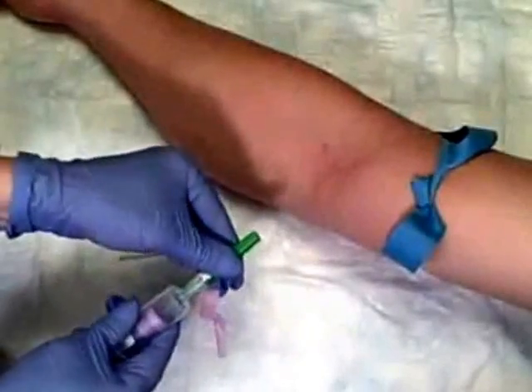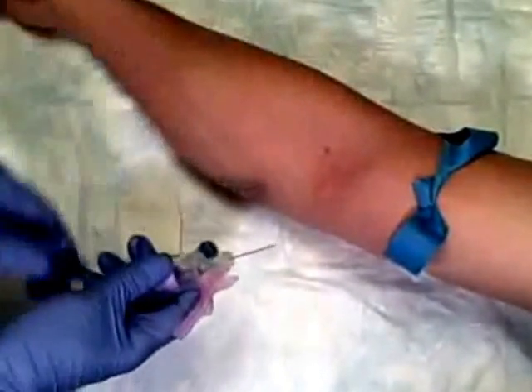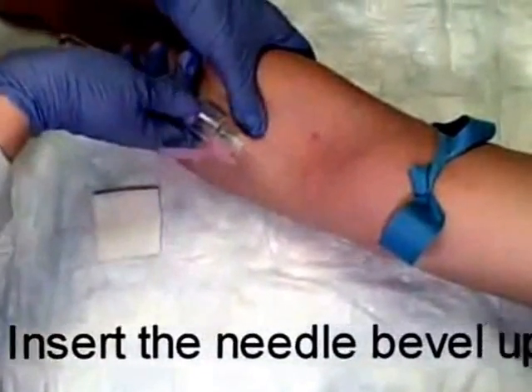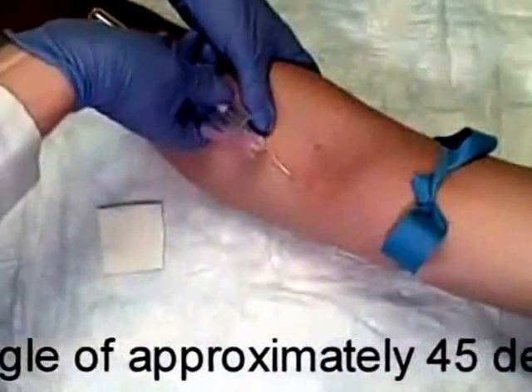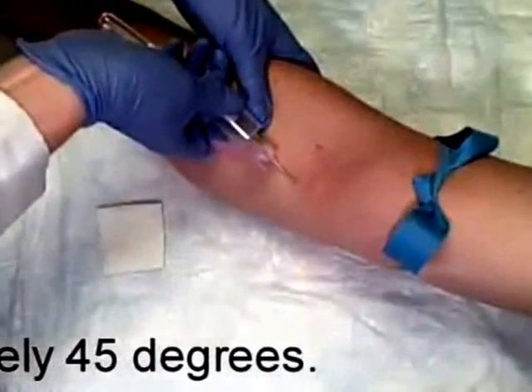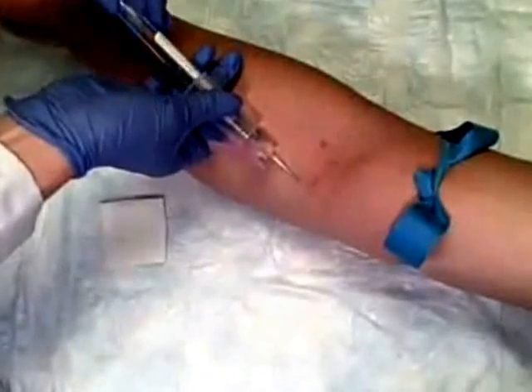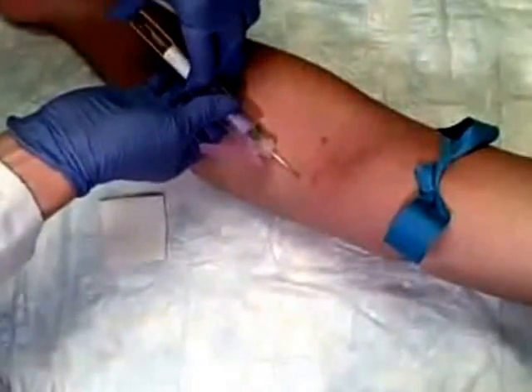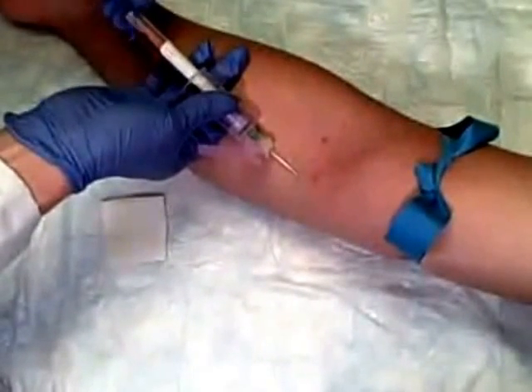I'm going to remove the cap from the needle, pull traction, and begin the procedure. You're going to feel a poke. With a straight needle, you don't get a flashback, so you just have to assume that you're in — and we are. You can see the blood automatically begins filling this.